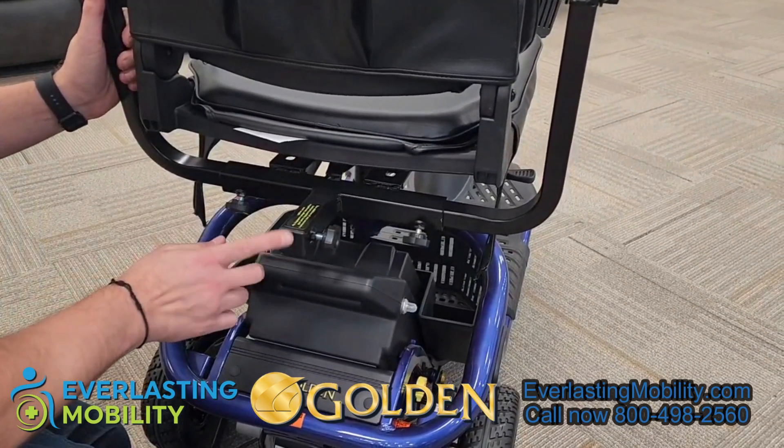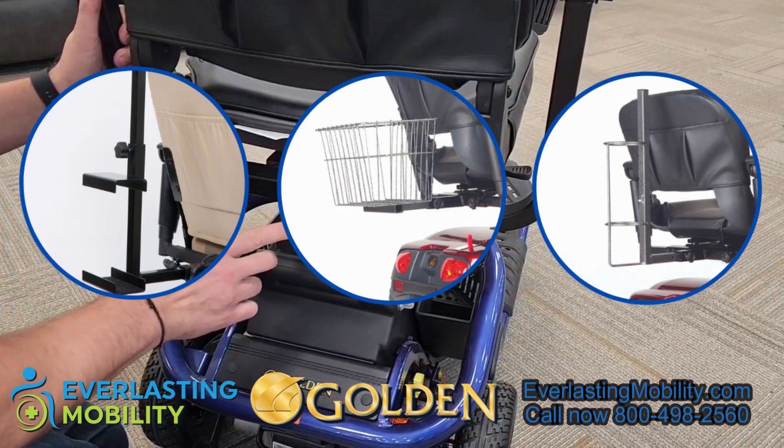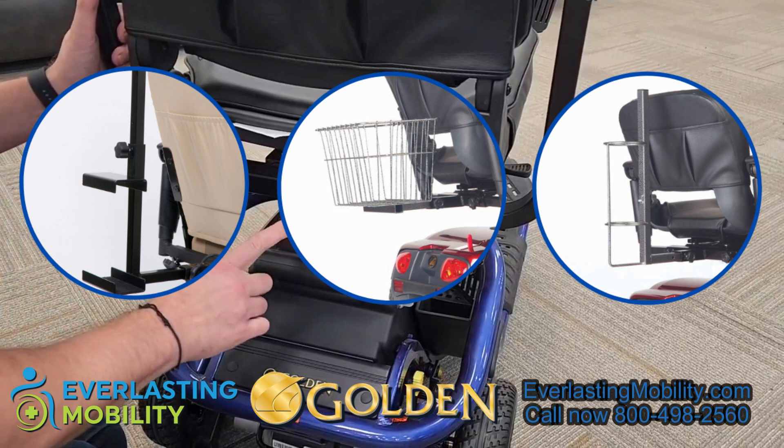There's also a universal accessory hitch on the back so you can put different accessories on the back of the scooter. To see what is offered, you can visit our product page and see what accessories you can add to this.